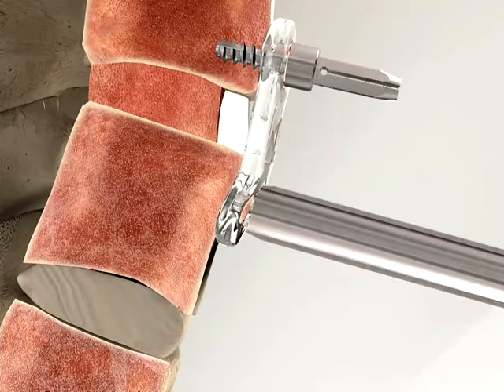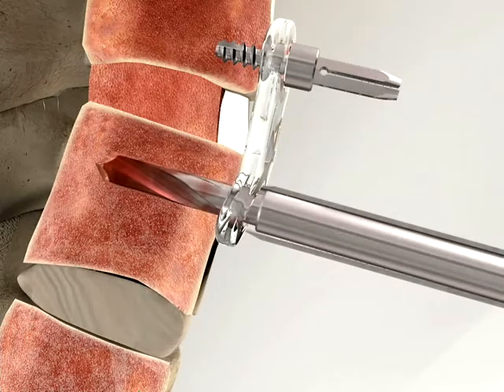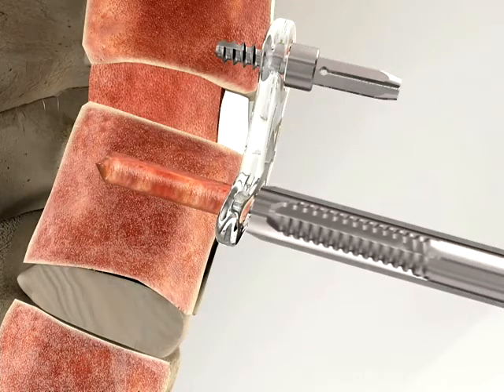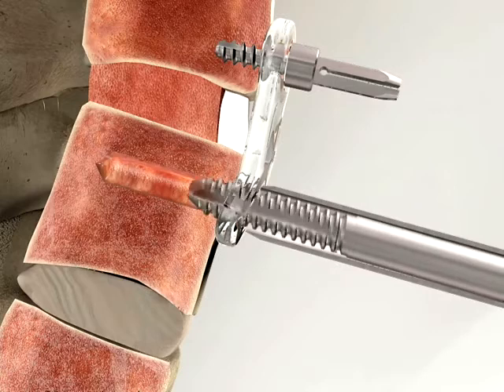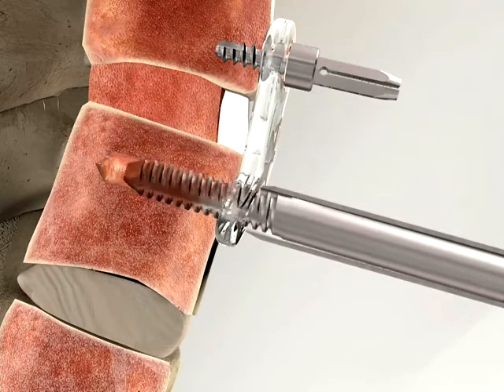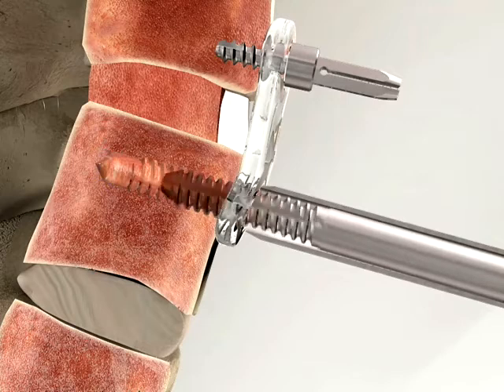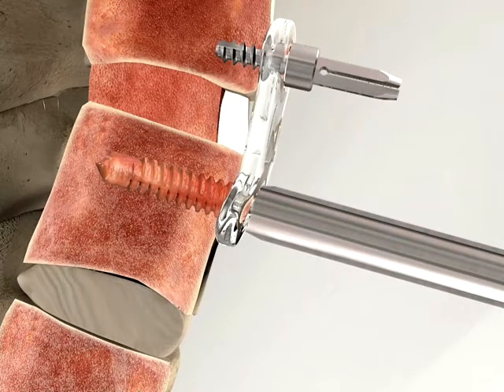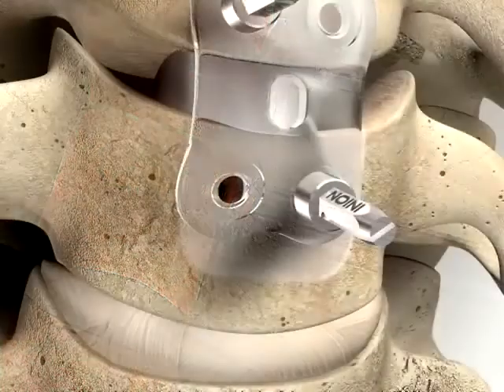The final screw hole is drilled using the correct size drill bit attached to a slow speed drill. The drill should be used at no more than 2000 revolutions per minute. The drill guide should be kept in its exact angle for subsequent tapping. Drills and taps are colour-coded according to the screw lengths. Manually tap the hole through the drill guide using the correctly sized tap attached to the screwdriver handle. Stop tapping when the tap hits the stop on the drill guide to avoid the risk of stripping the thread. The drill guide is used to press the plate firmly against the bone before tapping is started.